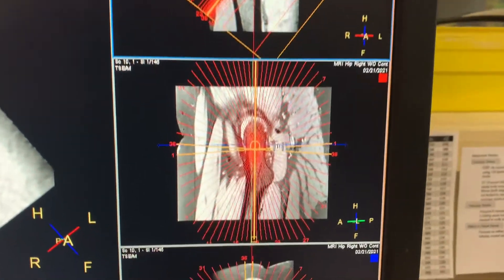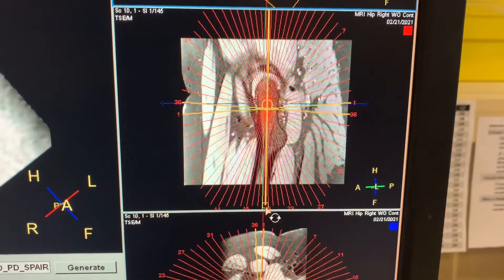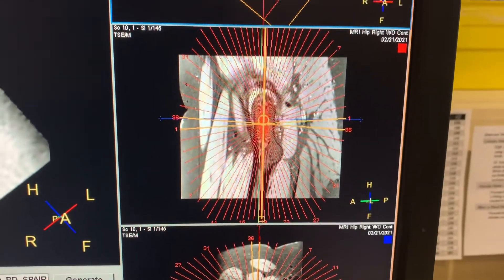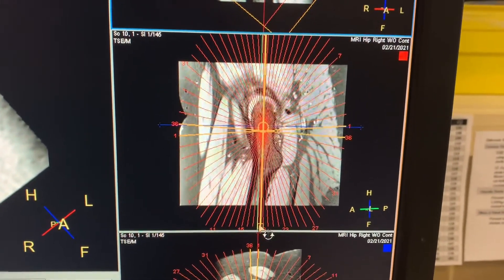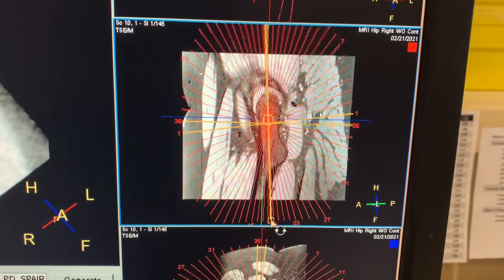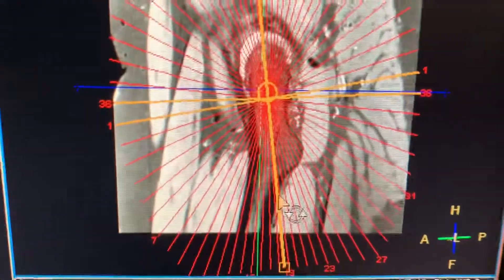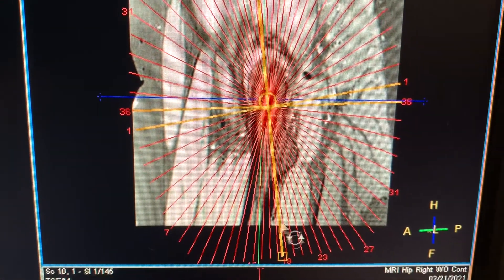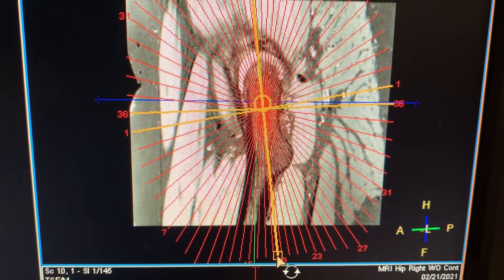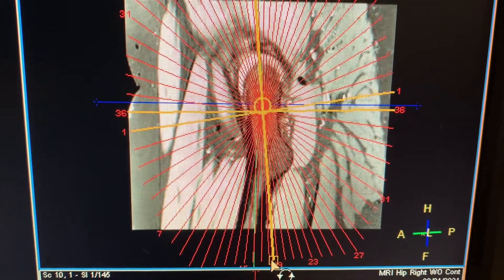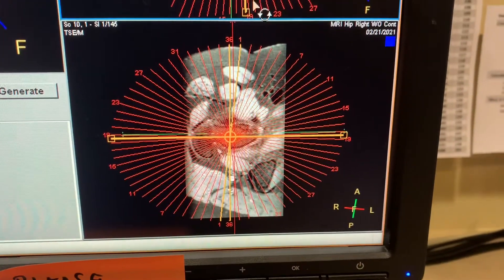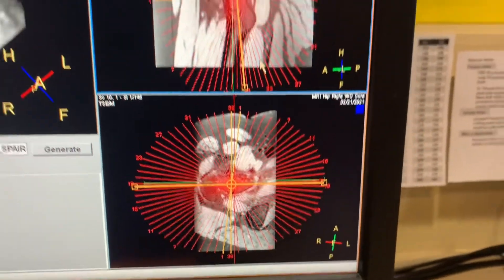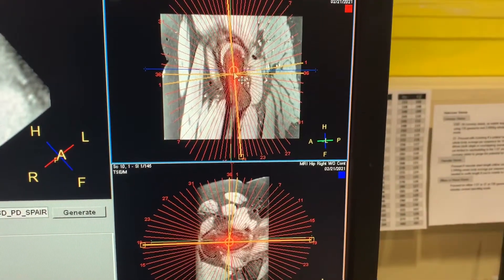Then let go, go back, and tilt the yellow line with the circle parallel to the neck — right there, that's a really good spot. Then go back to the bottom image.